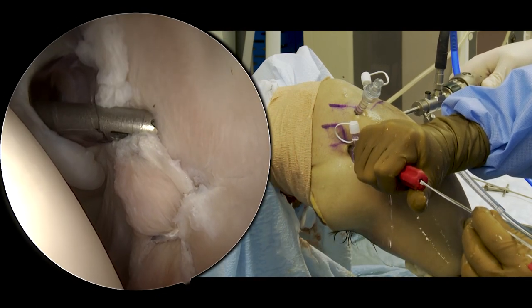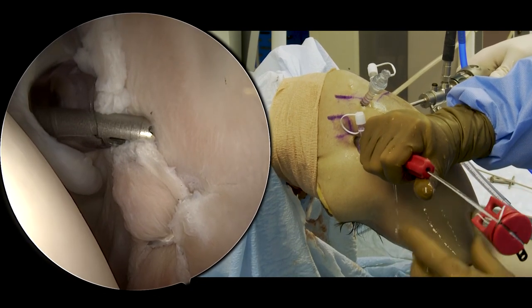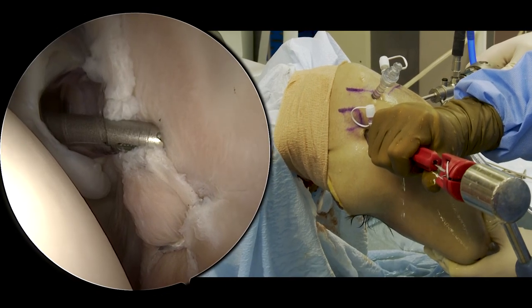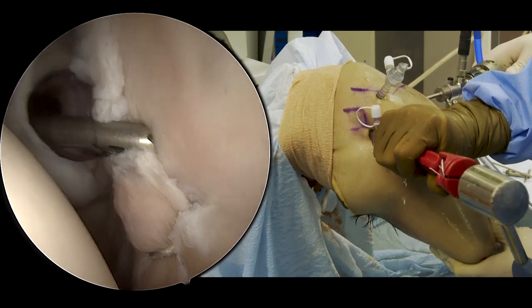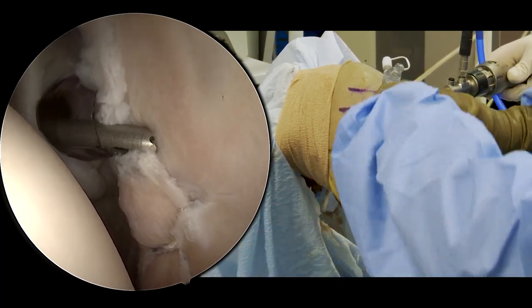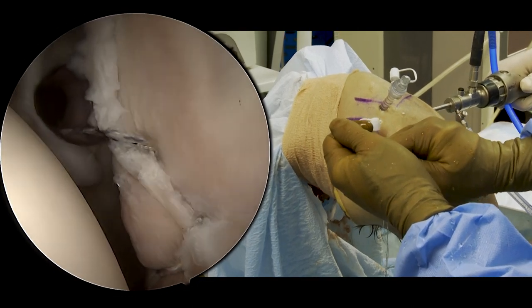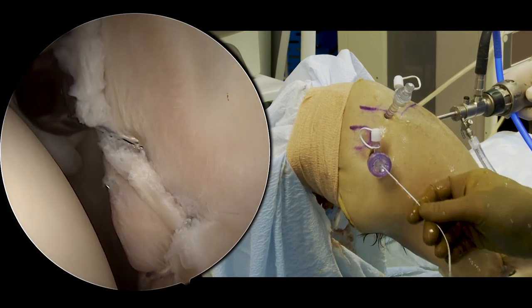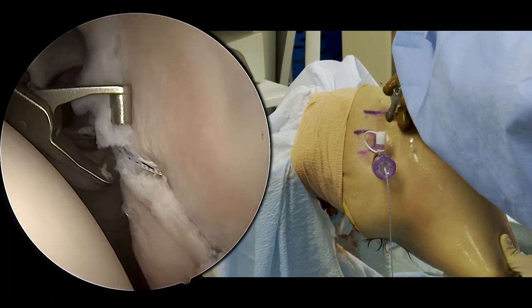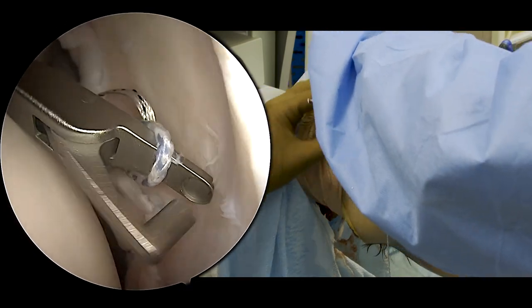Grab this anchor in the middle to the front so that you have control over it, then you can insert it and slide it down. You should try and push it in first to get it started — that means it's aligned well with the bone socket you made. Then tap it into place until the inserter is flush with the guide. Pull the suture retriever grommet off, then just pull the whole inserter off. Pull back on it just to set it and make sure that anchor deploys underneath the surface of the glenoid. Then we'll retrieve the repair suture — there are three sutures here: one is the repair suture, which is the blue one, and the other two are the shuttling sutures, which are one suture that passes through the center of the anchor.